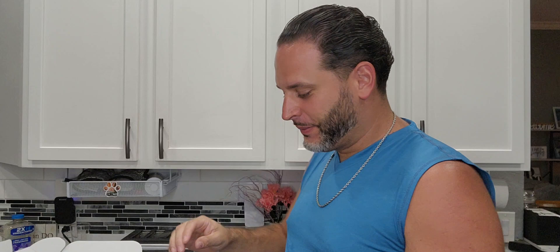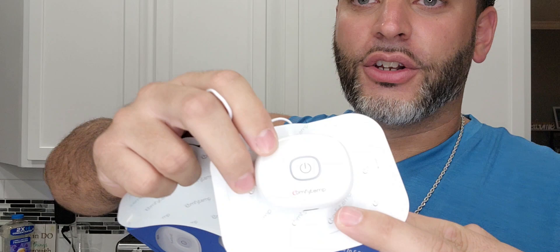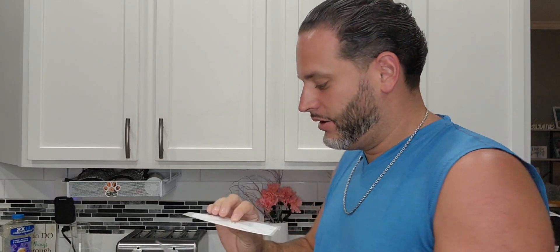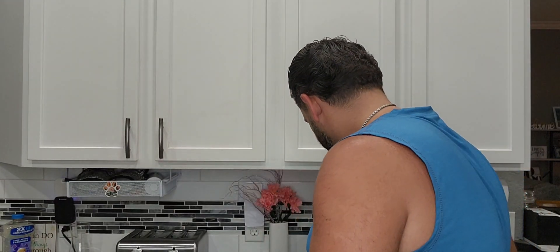Let me show you everything that's included. First, we have our remote control right here, which I'll go over in just a second. You also have these pads — you can use two at a time. There's a simple power button, and once you power everything on it automatically connects, which is great. Then you have two more pads here, and lastly some additional ones as well.